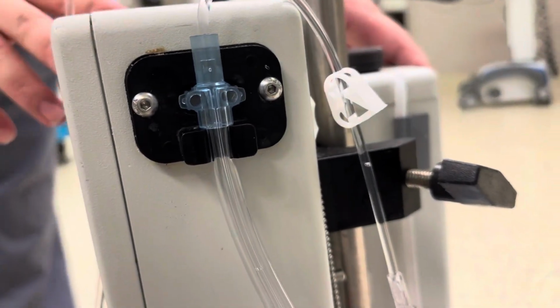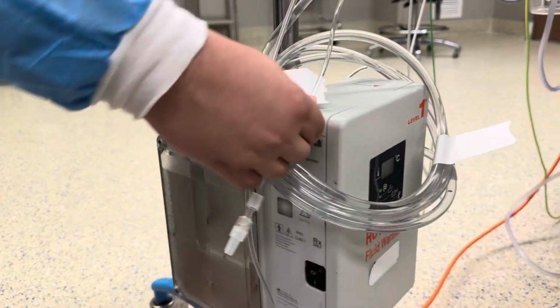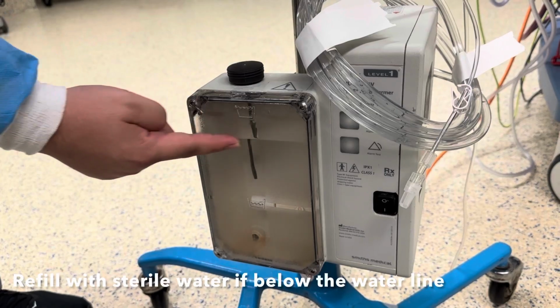Then you're going to go ahead and turn on our box. There's a little switch back here. You're going to look at the water level as well on the side right here. If it was below this water line, it would start beeping and it wouldn't work. So you just want to make sure it's above the water line, so we're good now.